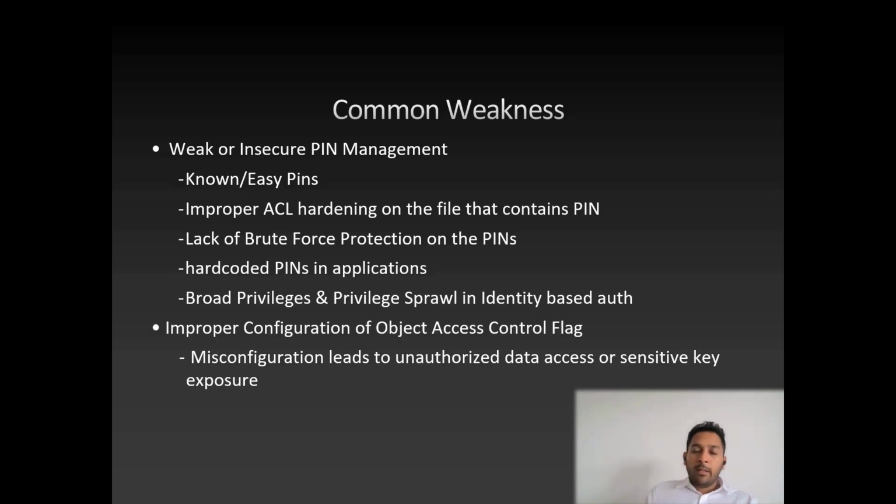All right, let's look at other common weaknesses. The main weakness is weak or insecure pin management. Sometimes applications just use known or easy pins or default pins that come with the firmware, and sometimes these pins can be stored on the flat file system because your application needs to have access to these pins to talk to the slots.